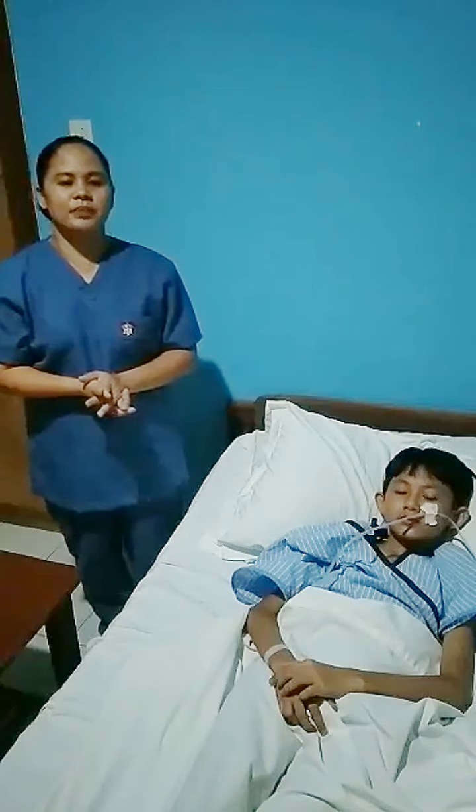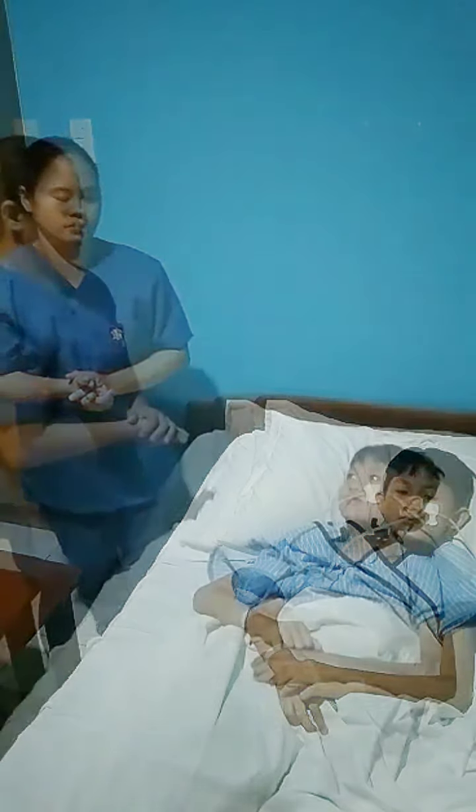Next is to explain to the patient what we will be doing and also inform the patient to let you know as soon as possible if he feels like vomiting. Then we can stop the feeding.